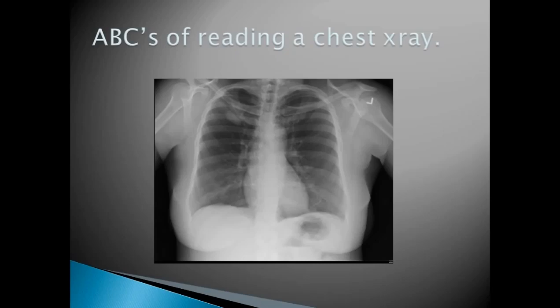I don't really have time to go through all of that, nor do I probably have the pictures to show you the difference between somebody who's lying down in a bed and somebody who's standing up. But anytime you can get them to stand up, you're going to get a much better view of the chest. So here's the mnemonic PIER. You should know that. I don't know that I'll have it on the exam, but I might. So you're going to want to know that for a couple of reasons. One, just because you need to know it for practicing and reading a chest x-ray.